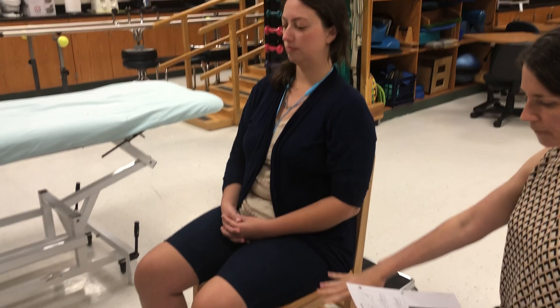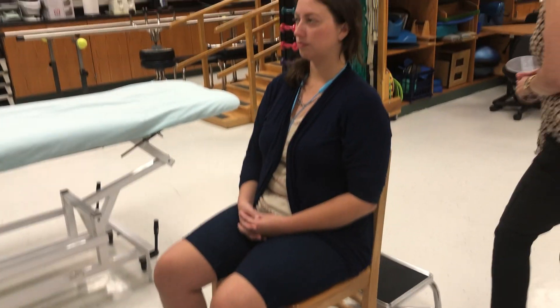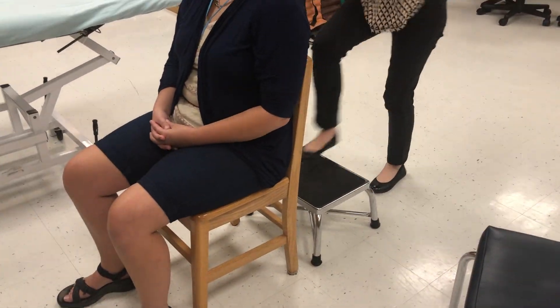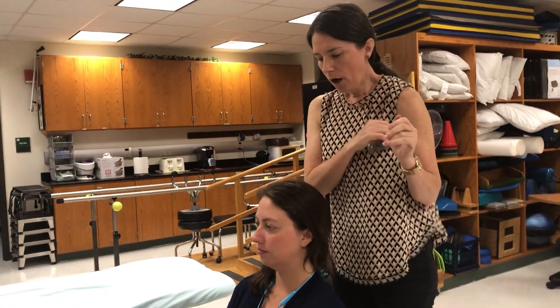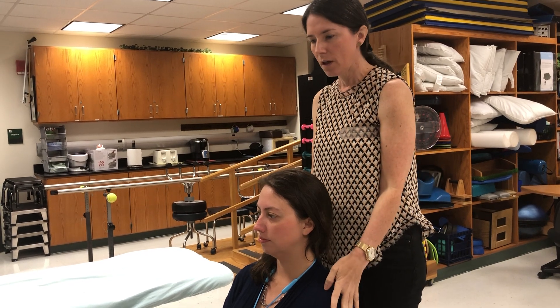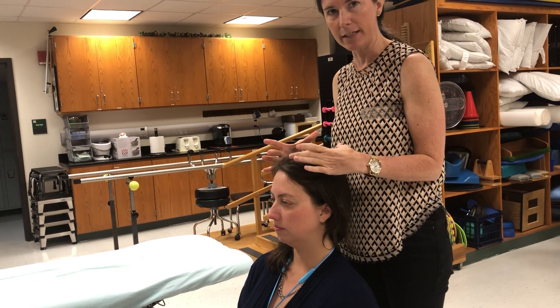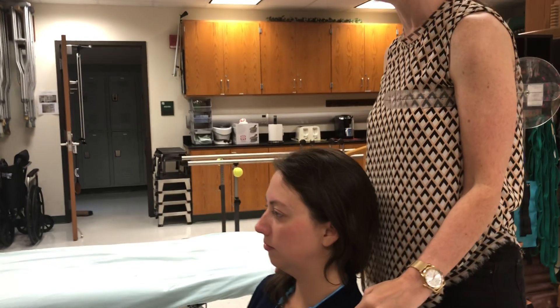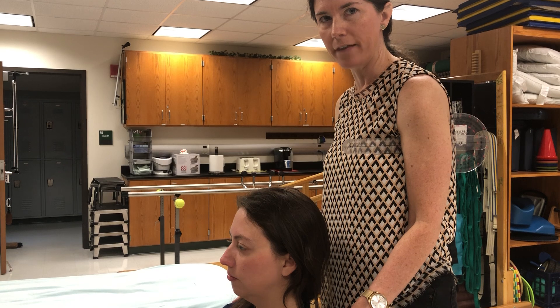The patient position is sitting in a wooden chair, back supported, feet supported. The clinician is going to be standing on a stool behind the patient so that I can look down at the patient as I'm doing my measurements. The fulcrum is going to be placed at the center of the cranial aspect of the head, and the stationary arm is going to be parallel to the line that connects the two acromion processes, so I have to orient myself to that first.